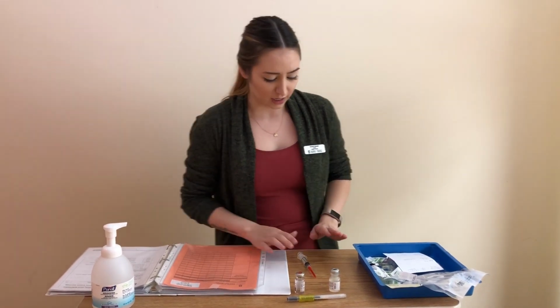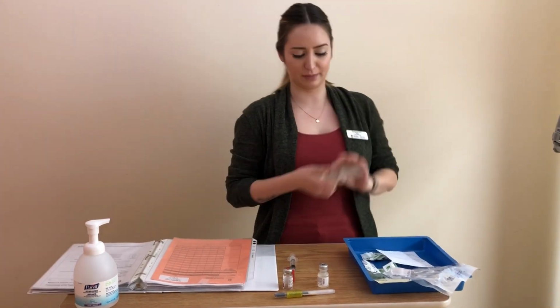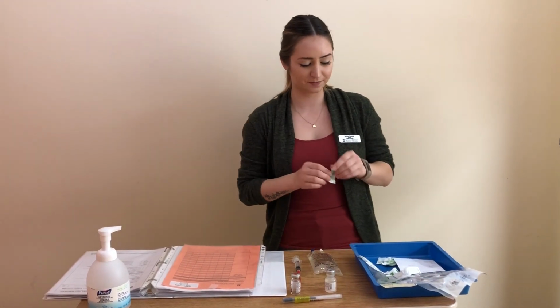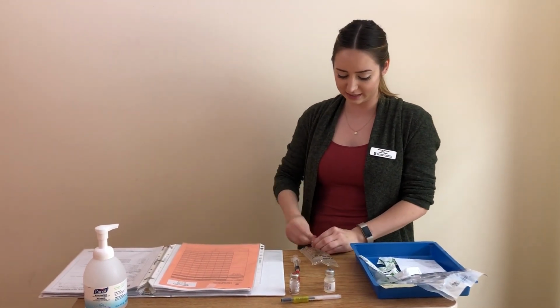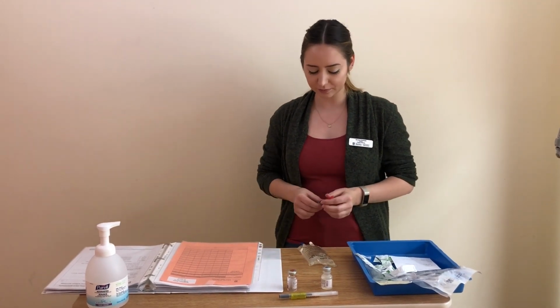So now I'm going to further dilute my medication in my 100 milliliter mini bag. So I'm going to swab the port for 30 seconds and let it dry for 15. You can even do the safety check there.